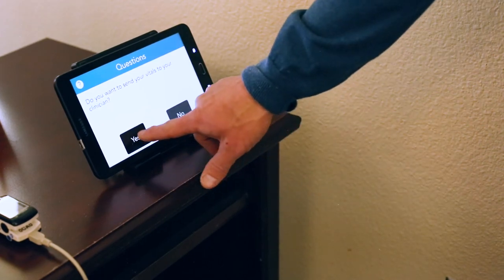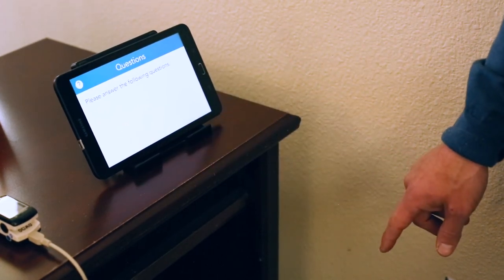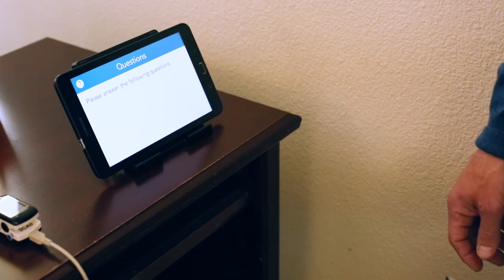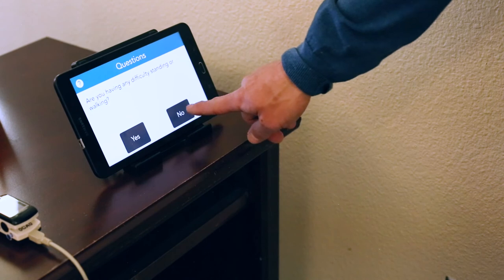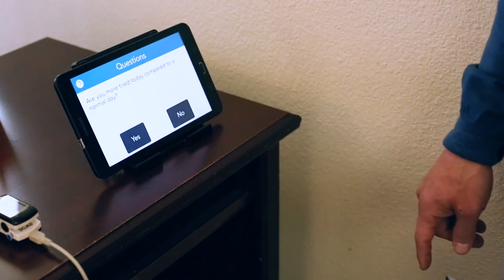First, it will ask yes or no questions that your clinician has assigned to you. After the questions are answered, it will walk you through exactly what to do with the equipment. Follow all prompts.